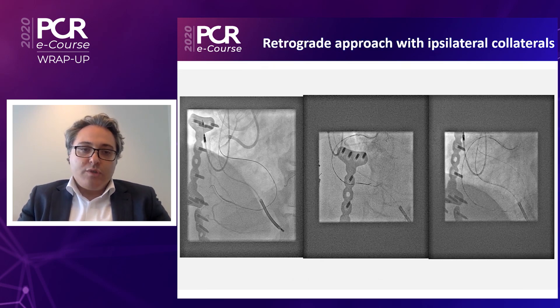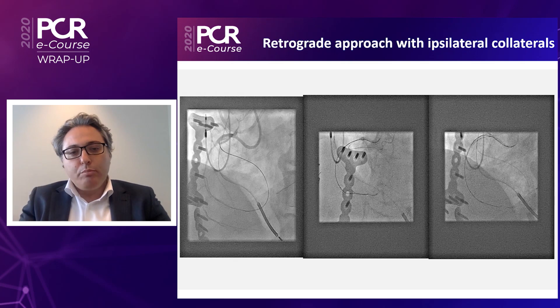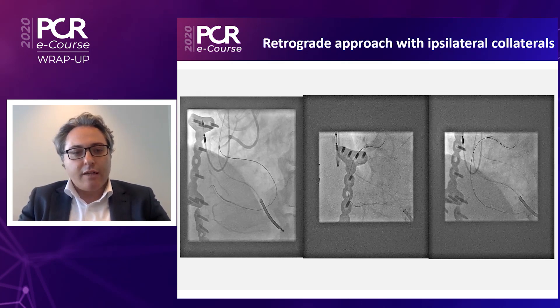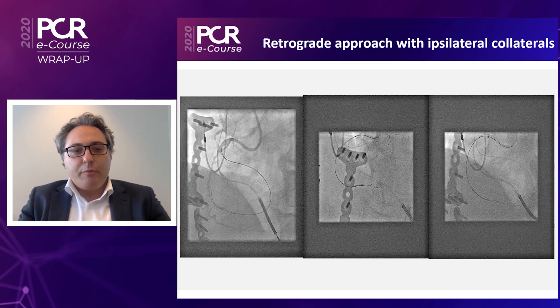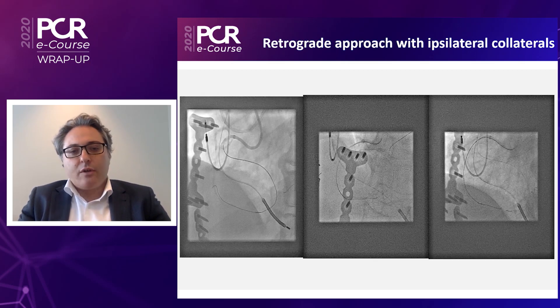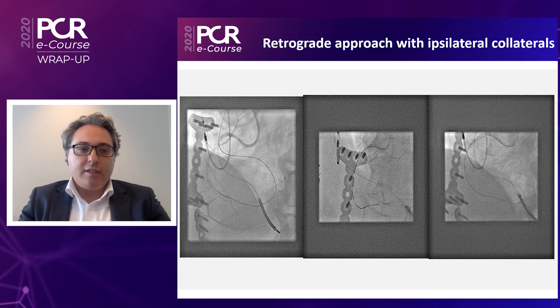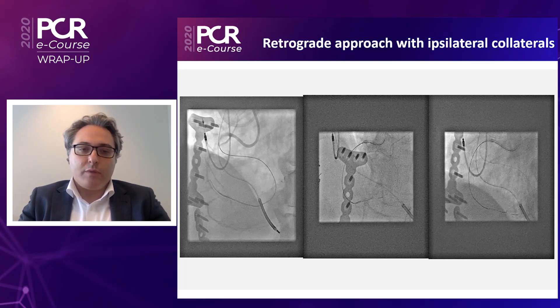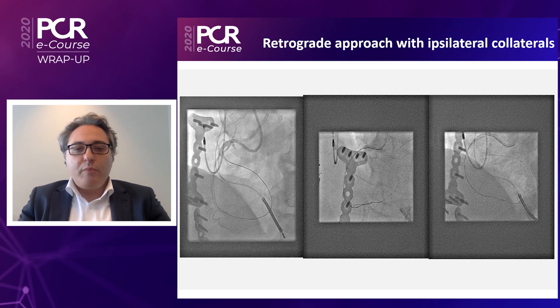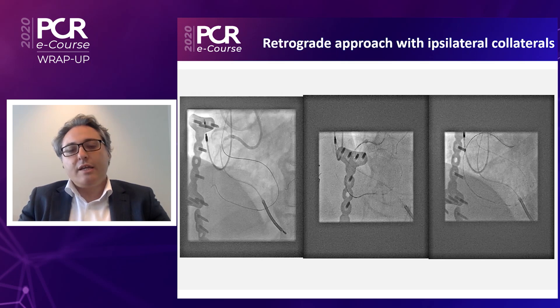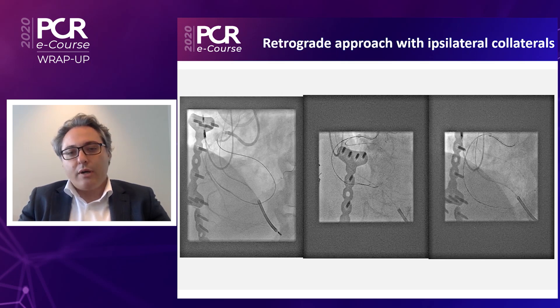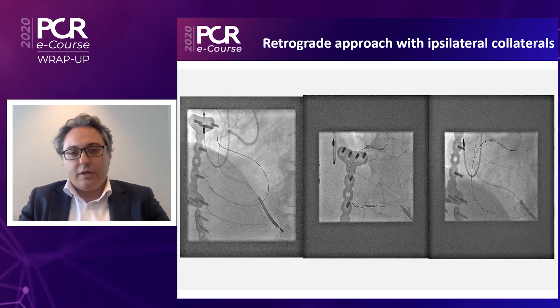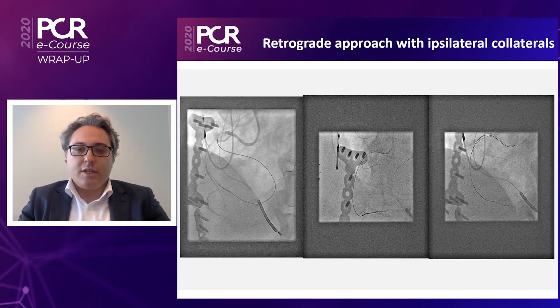We made a full loop from the ipsilateral epicardial collateral and went up to the distal right. We made the dissection retrogradely — we already had that dissection from proximally. So we performed a reverse CART technique and ended with our retrograde wire in the guiding catheter.